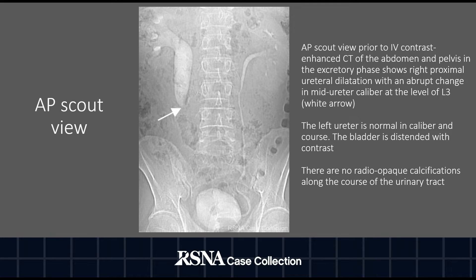AP scout view prior to IV contrast-enhanced CT of the abdomen and pelvis in the excretory phase shows right proximal ureteral dilatation with an abrupt change in mid-ureter caliber at the level of L3, as indicated by the white arrow. The left ureter is normal in caliber and course. The bladder is distended with contrast. There are no radiopaque calcifications along the course of the urinary tract.